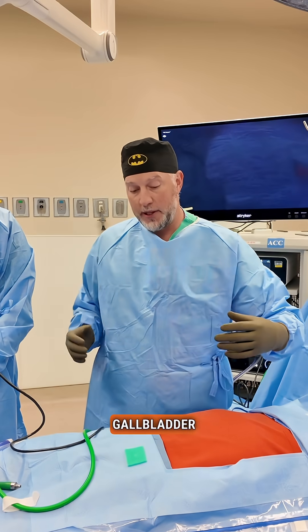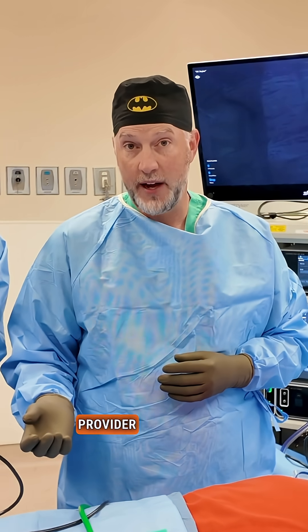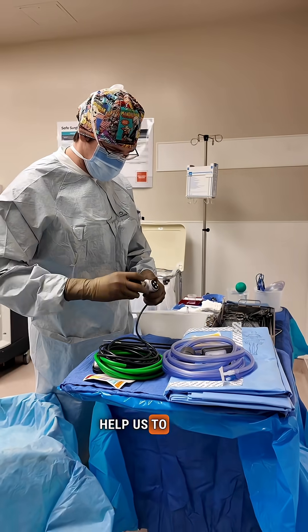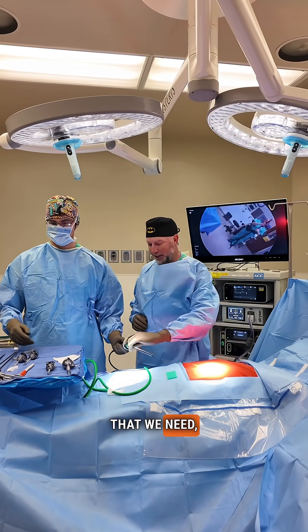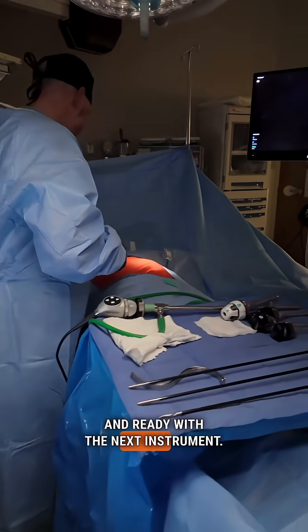The group that helps take out your gallbladder includes the surgeon. Often we have an assistant — whether that's a resident, an advanced practice provider, or a registered nurse on the team. We also have our scrub techs that help us clean the back table, get everything organized, hand us the instruments we need, and oftentimes they are anticipating the next part of the operation, ready with the next instrument.